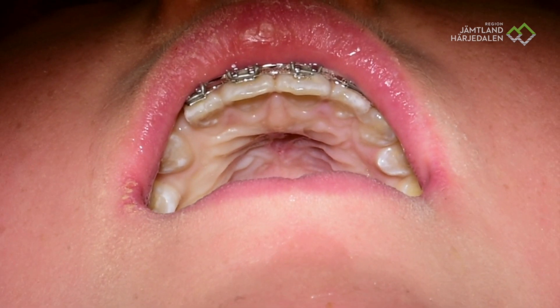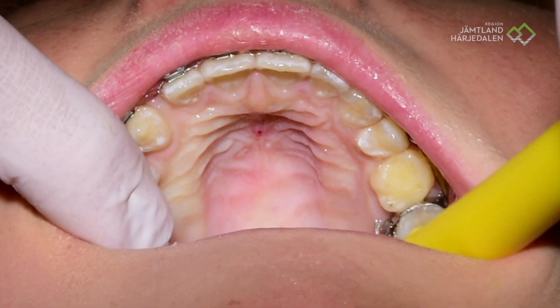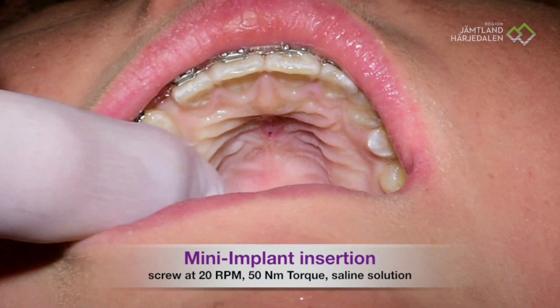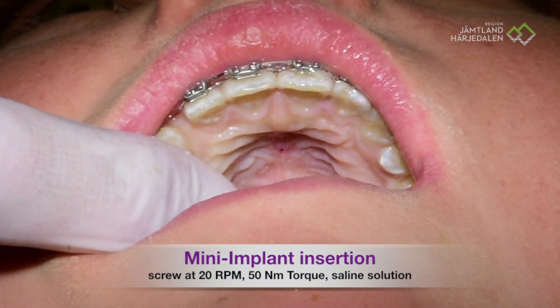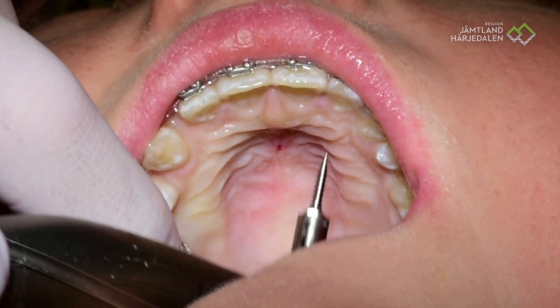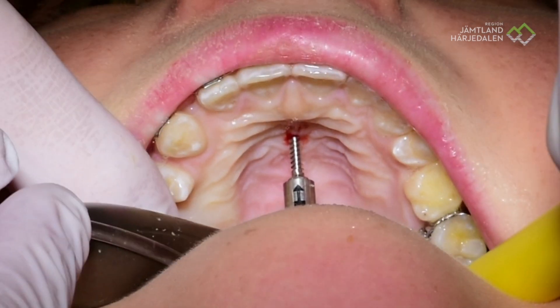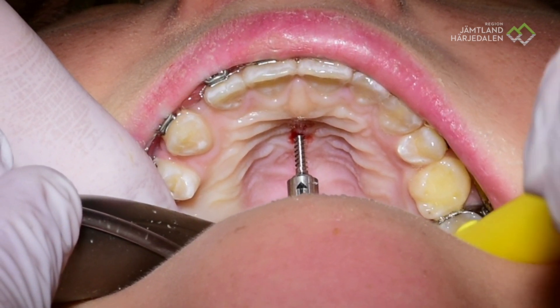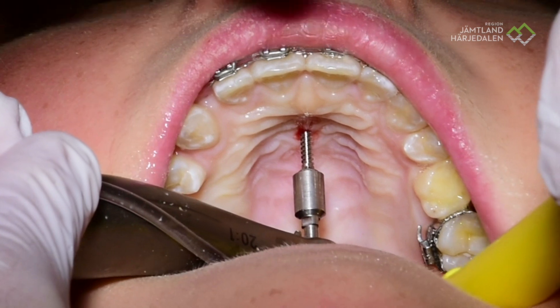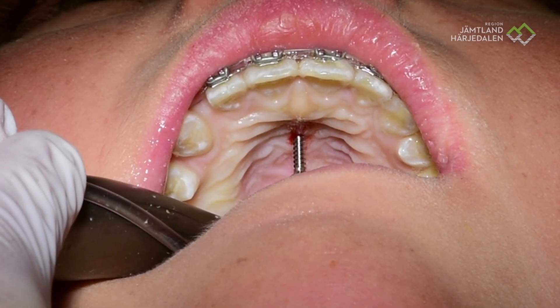Then we put the piercing now. Open your mouth — you can see there is no bleeding, nothing. You can almost not see anything. Sometimes we get some bleeding, but most of the time nothing. Then we will put this inside the mark, at the right angle. It is very important to get the right angle from the beginning. Now we are starting. Remember to get the water to the maximum.